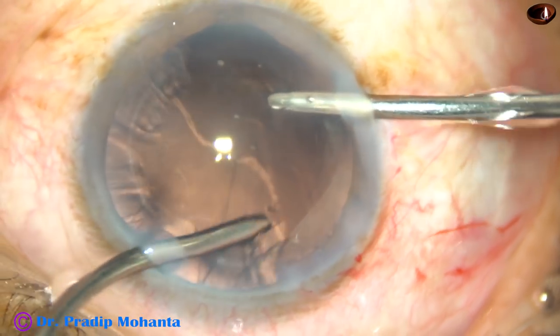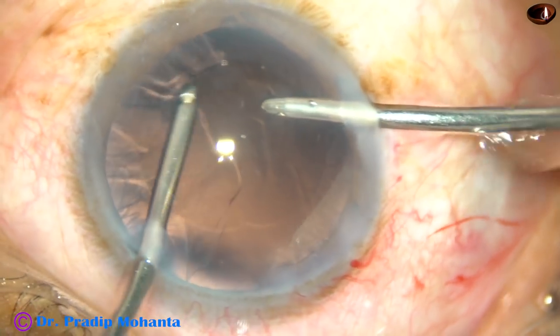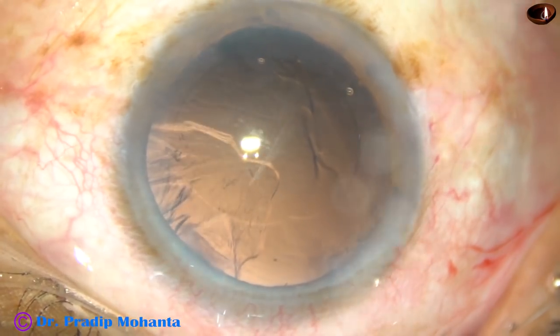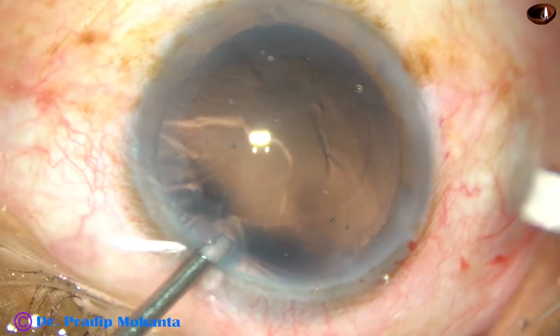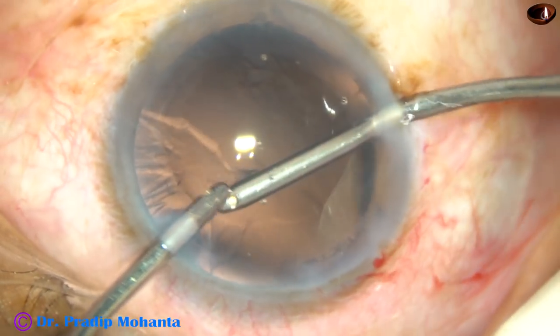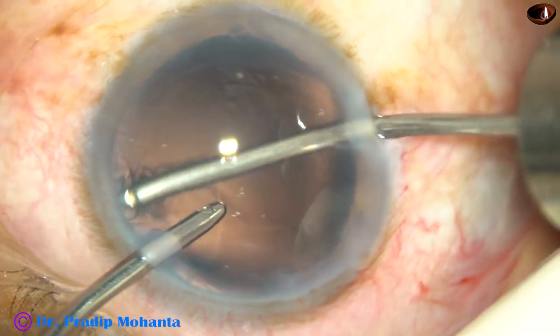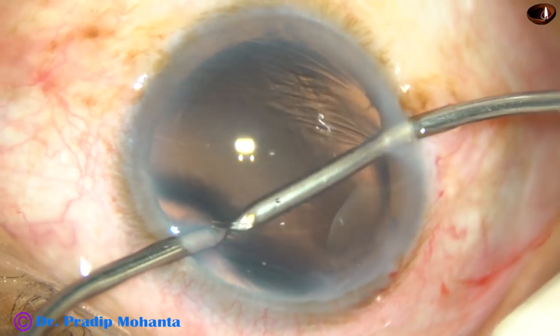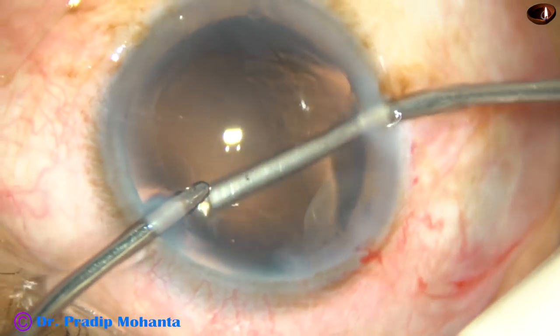At this moment, irrigation is from the right side and aspiration from the left. Now you change hands — irrigation is from the left and aspiration from the right sideport. And very comfortably, you can remove the cortical matter.